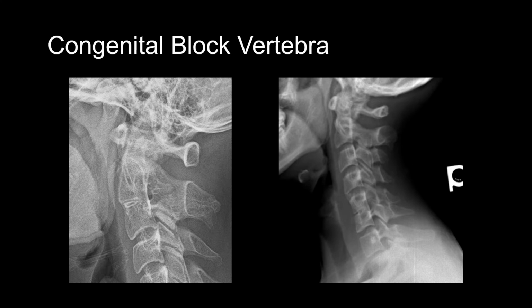Here are some examples, just like this one. This was that same example, and this is another example at C2 and C3. And you can see here the posterior elements are also fused.